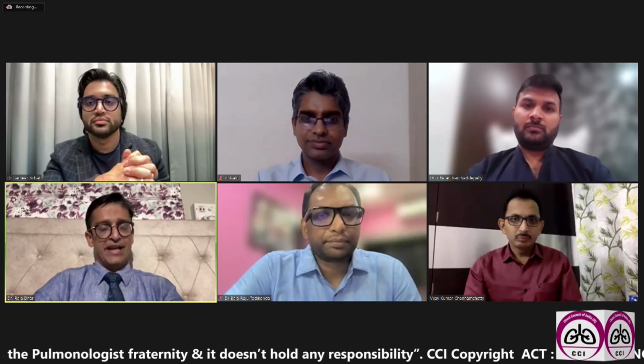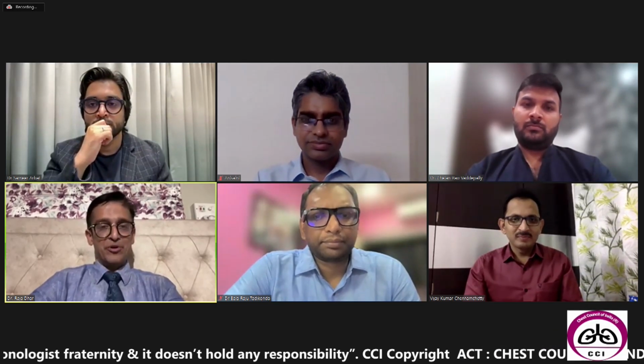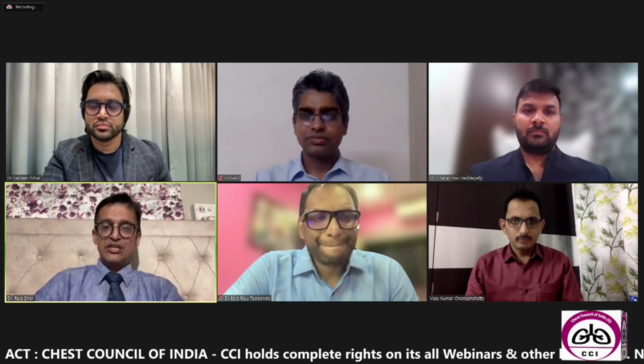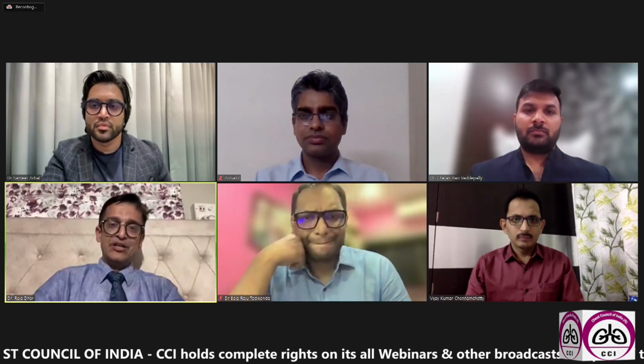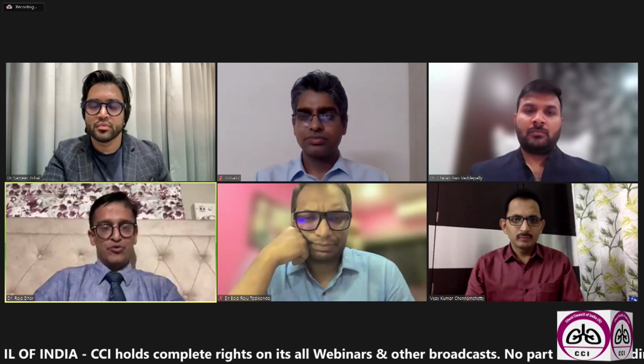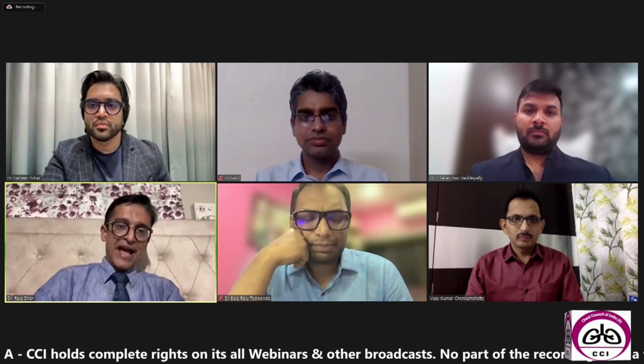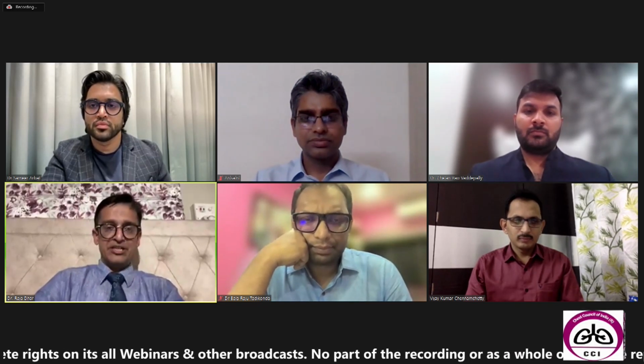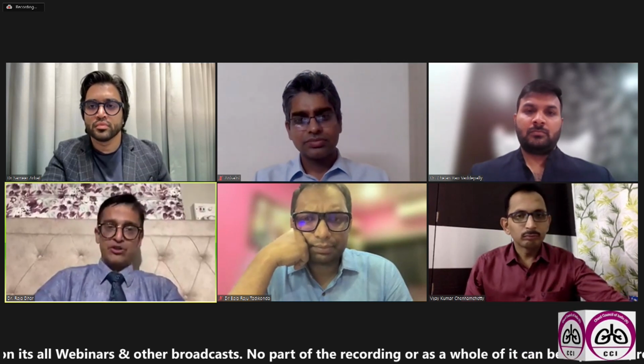Yeah, grand. So very nicely put. I'll try and explain a couple of statements that you made a little bit further, especially about the ILD cryobiopsy. So I agree with you, Sameer, that the indications for doing cryobiopsies in ILD have gone down. I wouldn't say they've gone down radically, because I don't think it's just a question about steroids. I think it's also a question about the amount of fibrosis versus the amount of inflammation. And that tells you about prognostication in these individuals, which also is an important part of dealing with interstitial lung disease. So I think what you say is absolutely right in principle.